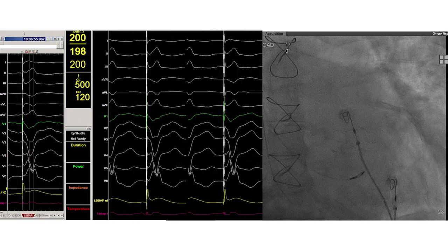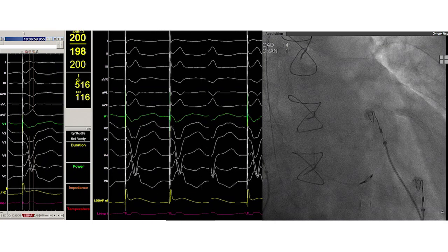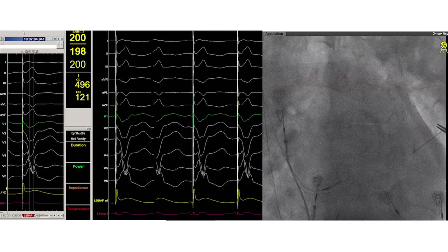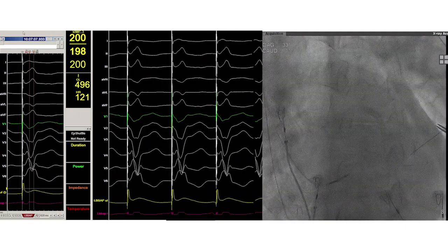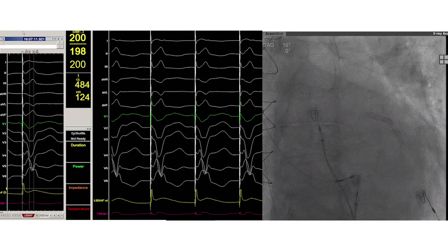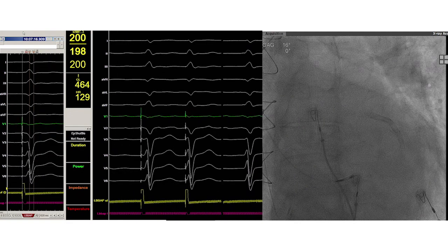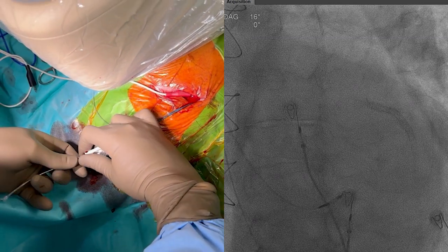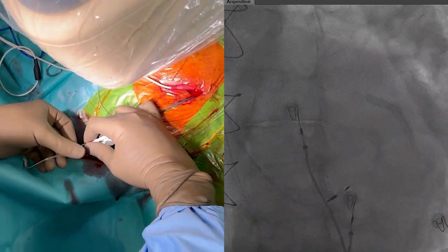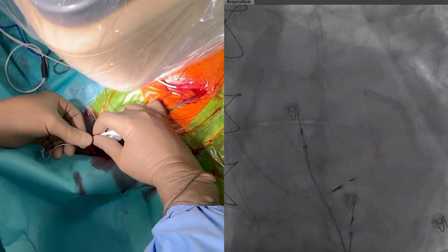Turning the fluoroscopy to RAO view reveals that the lead tip is pointing towards 2 o'clock. Now towards LAO view to make sure that the guiding catheter is placed perpendicular on the septum. Under a slight LAO view the lead is advanced into the septum using a few quick turns. Note how on fluoroscopy the lead moves through the interventricular septum towards the LV endocardium.